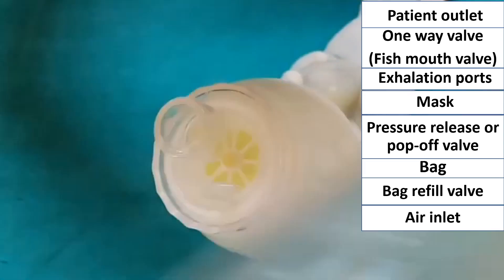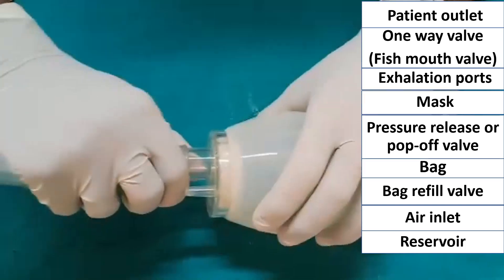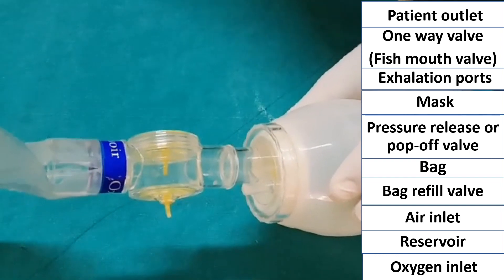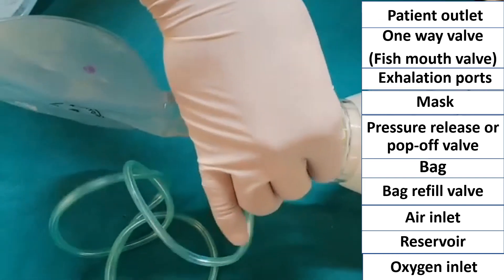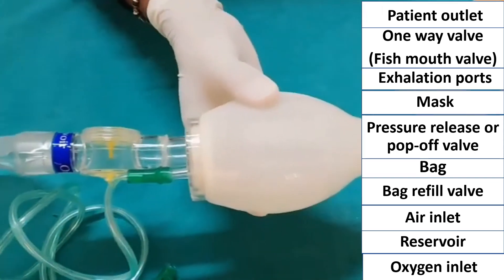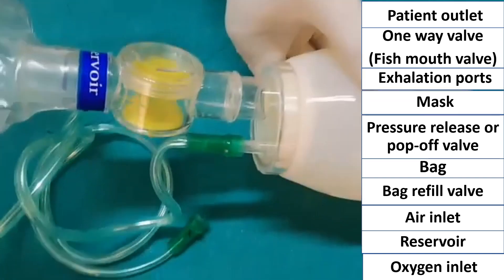This is the air inlet, and now I am attaching the reservoir to the air inlet. This is the oxygen inlet. Now I am attaching the oxygen tubing to the oxygen inlet. So this is the assembled Ambu bag.